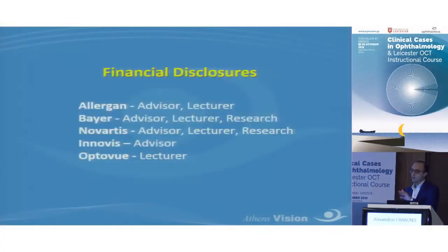In regards to the vitreoretinal interface and traction and so forth, this doesn't change regardless of whether you have a vascular disease, an age-related disease, an idiopathic disease, or uveitis. But let's concentrate a little bit on uveitis.